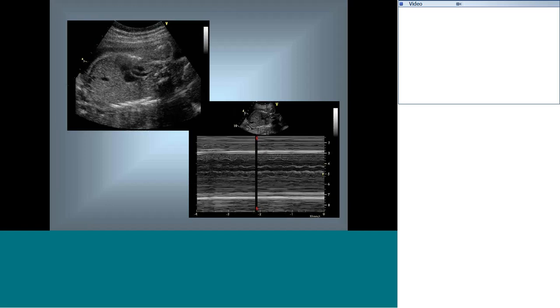The three-vessel view shows the SVC, the aorta, and the pulmonary artery. When in the subcostal sagittal plane where you open the SVC-IVC, a slight tilt of the probe will show all three vessels together in cross section. Normally, the SVC is smaller than the aorta, and the aorta is smaller than the pulmonary artery. Any discrepancy in sizes indicates a possible heart condition.